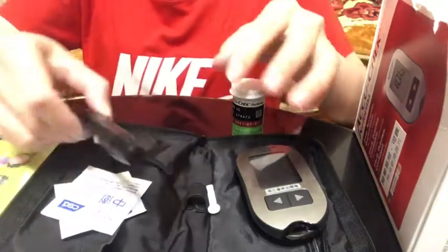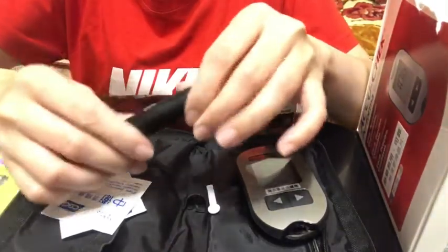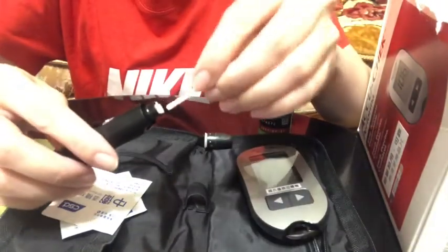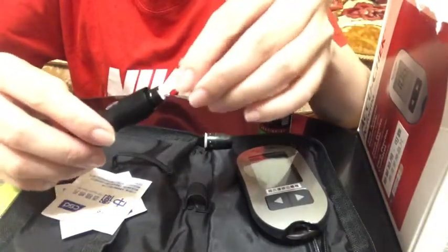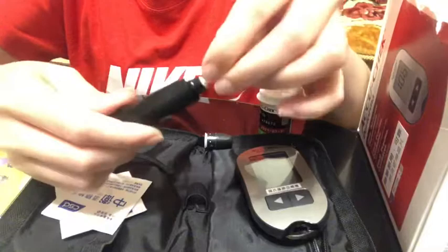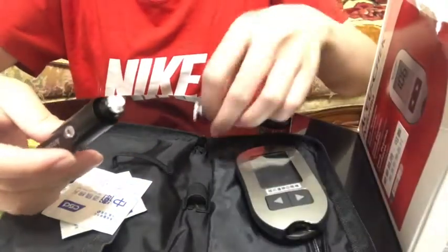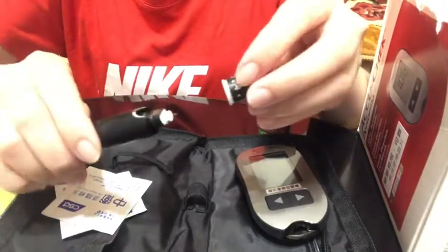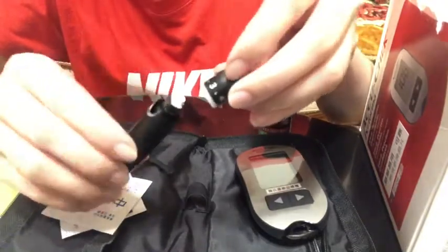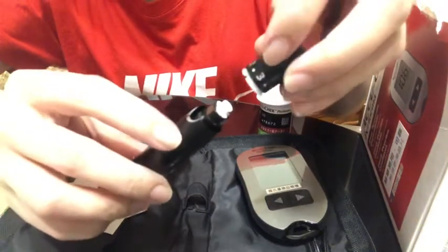Then prepare our Softclix lancing device. Remove the cap from your lancing device and insert the lancet into the lancet holder. Twist or remove the protective cap to expose the needle. Then place the cap back.